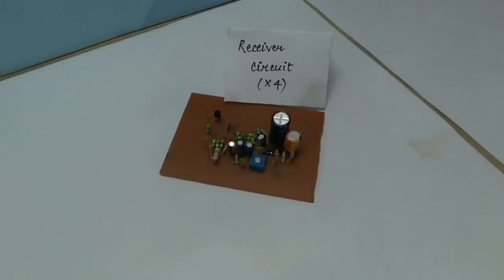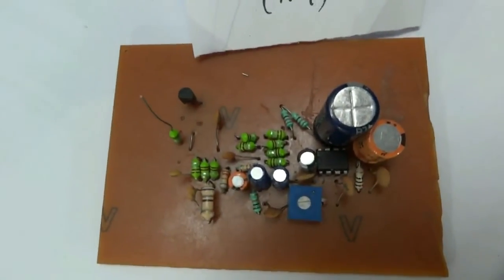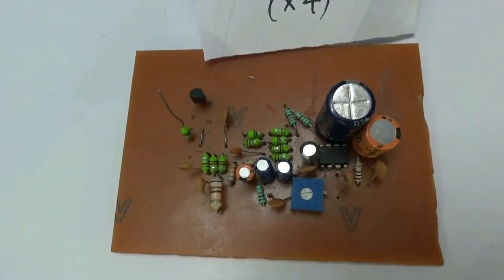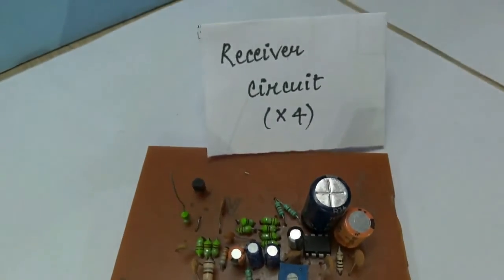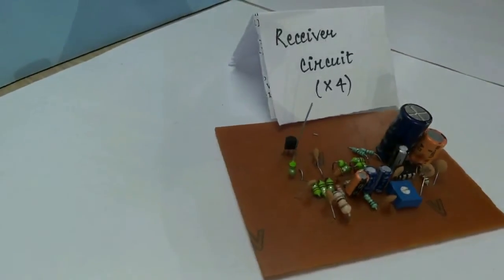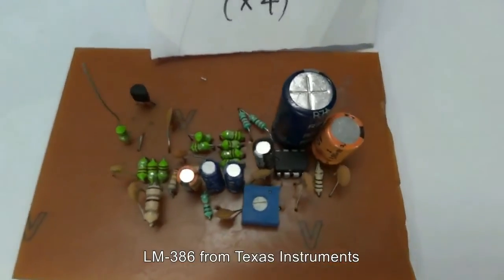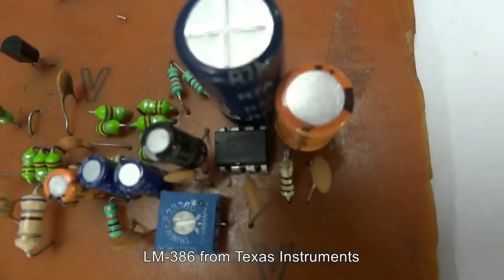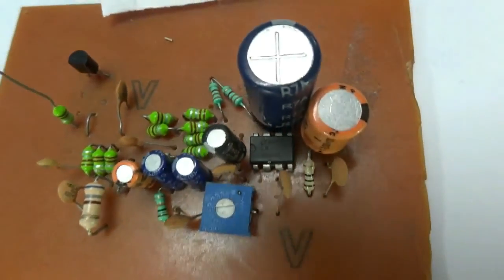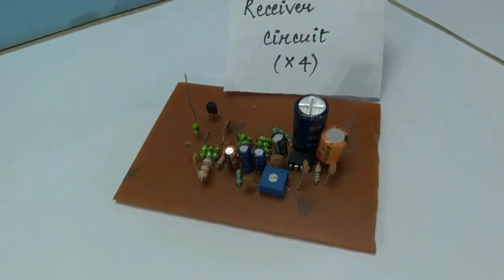The next module is the receiver module. Here we are showing one of the receiver modules. Actually, in the model we have 4 such modules. The receiver module has the main IC component, provided by Texas Instruments, the LM386, which is a low voltage audio amplifier. It amplifies the signal received from the transmitter before passing it on to the associated circuitry.